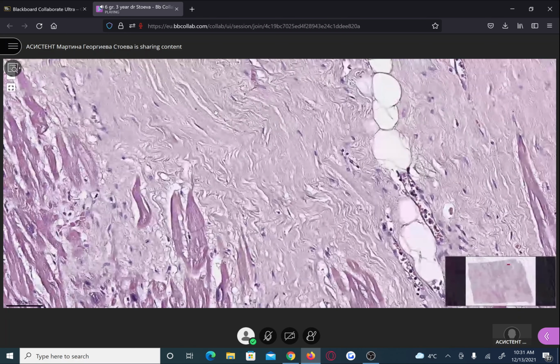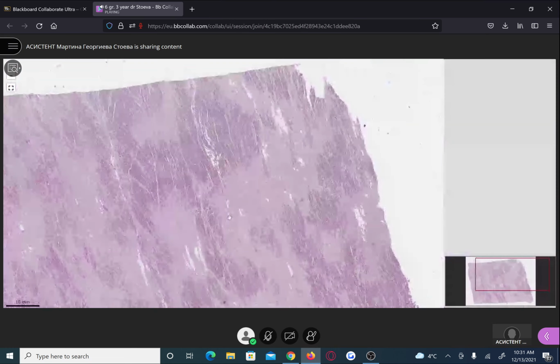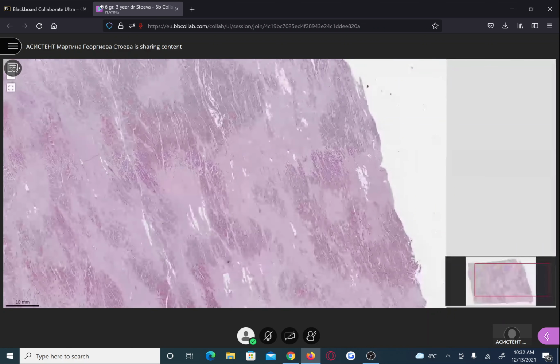This is the end stage of the infarction, known as myocardial cicatrix. It takes at least 6 weeks to develop. So if you are asked how old this infarction is, you should mention that it's at least 6 weeks, because once the connective tissue is formed, I can't tell you exactly if this is 2 months, 6 months, or 2 years after the infarction. It will look the same way once the matured connective tissue is formed.